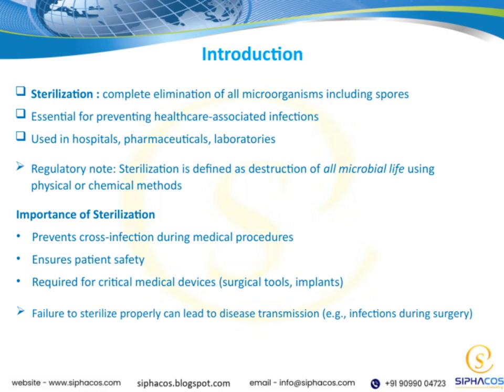This process is vital in healthcare settings, such as hospitals, pharmaceutical labs, and research laboratories, where preventing healthcare-associated infections is a top priority. And a quick regulatory note: sterilization is defined as the destruction of all microbial life, whether through physical methods like heat and radiation or chemical methods. This comprehensive approach helps ensure the safety and effectiveness of medical procedures and products.